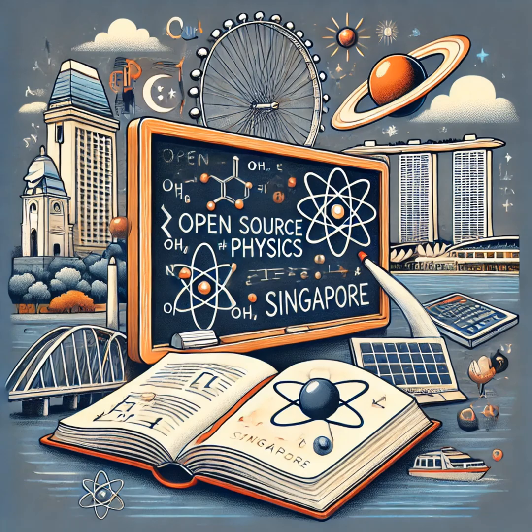Absolutely. Okay, so we've talked about what we can see in the image. Right. The shades of gray. But there's probably a lot going on that we can't see as well, right? Oh, definitely. There's a whole lot of physics happening behind the scenes. Like what kind of stuff? Well, we touched on scatter earlier, when we were talking about filtration. Scatter is a big deal in X-ray imaging. Okay, so remind me what scatter is again. It's when some of the X-rays don't travel in a straight line through the body. Oh, right.